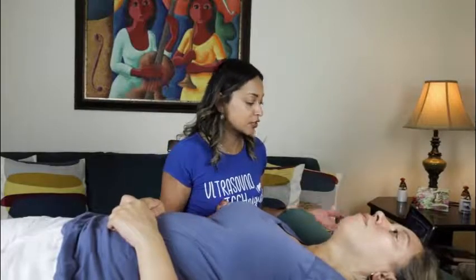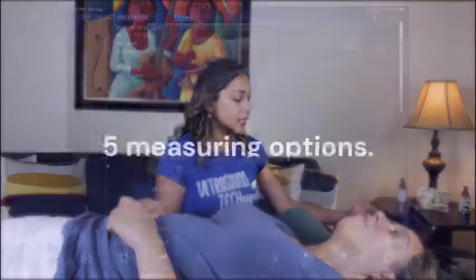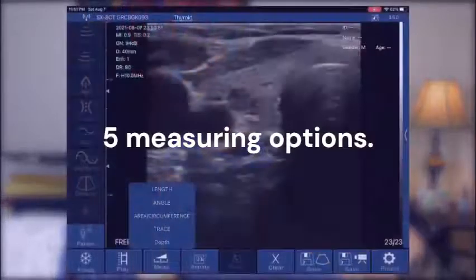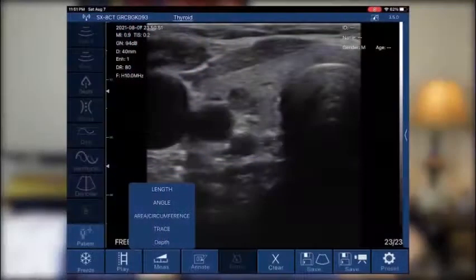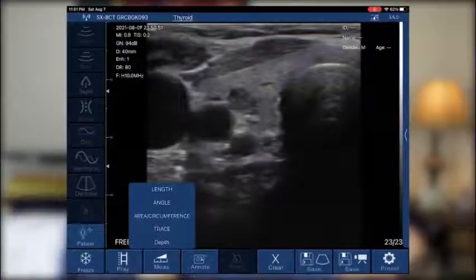I just froze it using the screen. Now that we freeze it, what can we do with this image? First, usually when you find a nodule or any abnormality when you're doing ultrasound, you need to measure. What are we measuring? The lengths. The options it gives us include length, angle, area, circumference, trace, and depth.